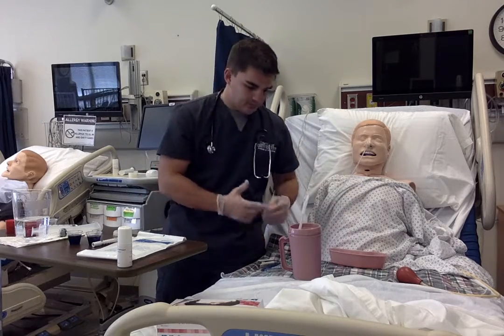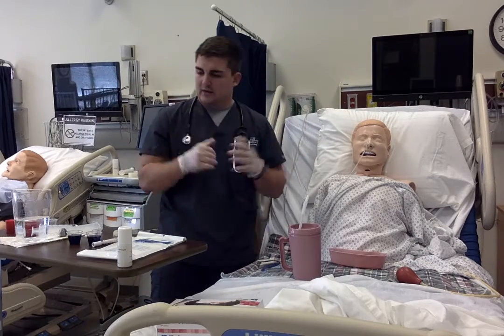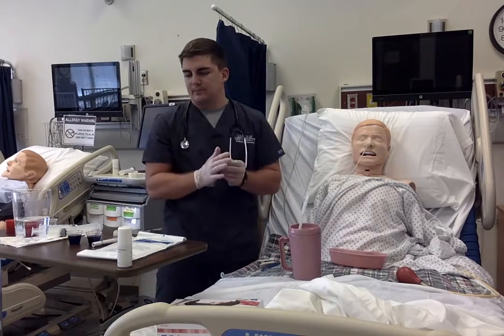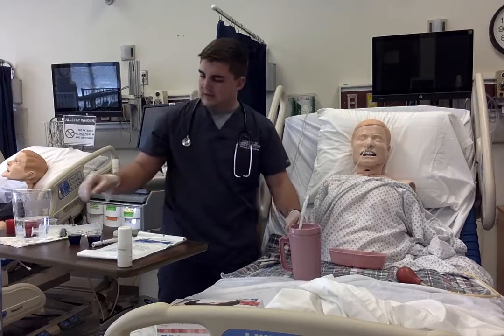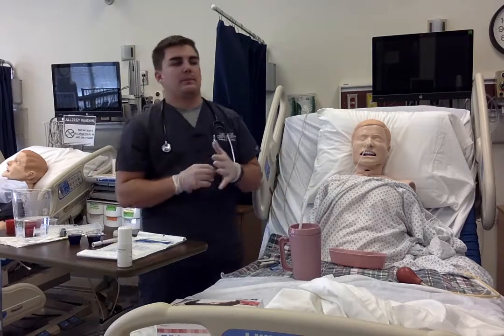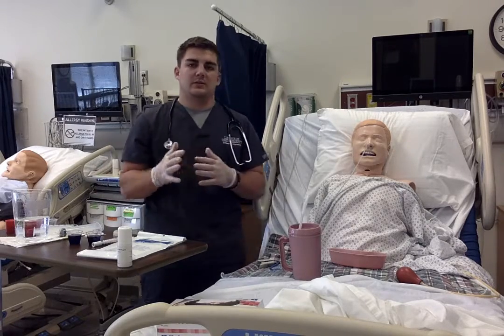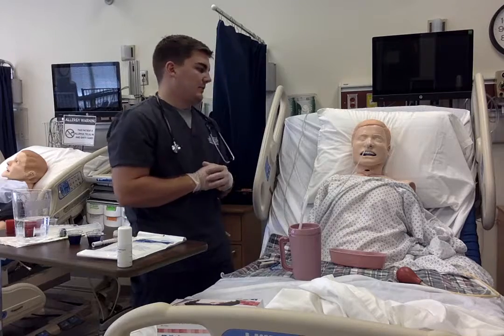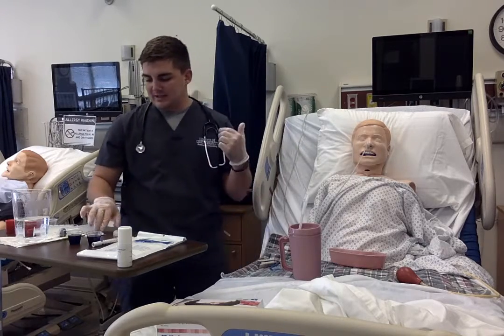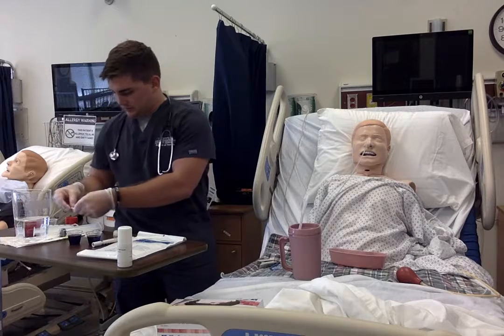Next would be the medication administration. Before doing that, I would get the medications, verifying the correct order, the right route, the right dose, and that they can be inserted through an NG tube, and verifying the patient's name and date of birth. First I would put the tablet into this crusher.